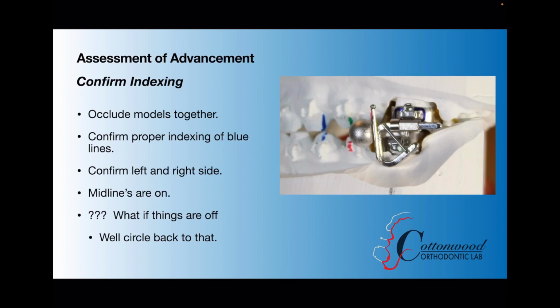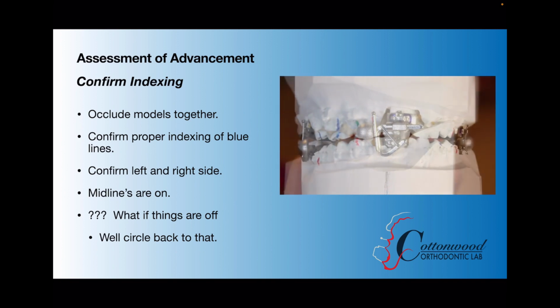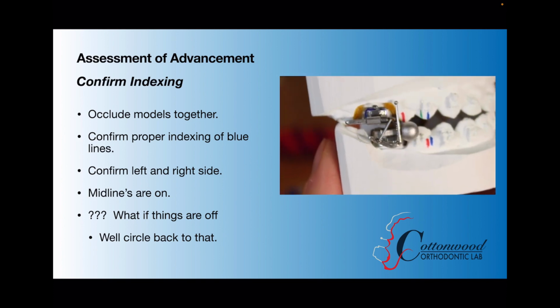So here we're taking a look at our advancement. Confirm that the indexing models of the upper and lower are right where you originally set them. And you can see in this one, that's true. Confirm the left and right sides are equal. And then you're going to want to make sure your midlines are on. Now you're asking yourself, well, what if things are off? Don't worry. We'll circle back to that.